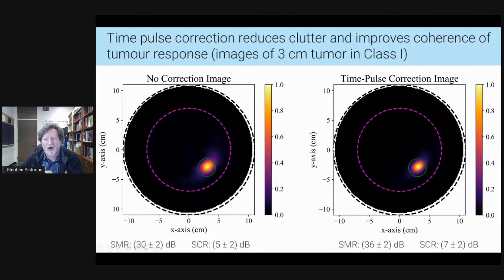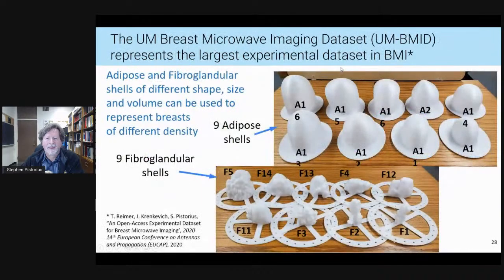These are 3 centimeter tumors in relatively fatty breasts. Now, one of the other benefits we bring to the research is that we believe we have probably the largest imaging data set available in the world as a result of these phantoms that have been developed.